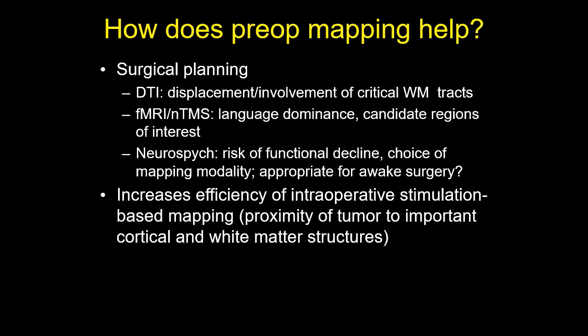In summary, these increase our efficiency of intraoperative stimulation-based mapping by demonstrating the proximity of the tumor to presumed critical cortical and white matter regions.